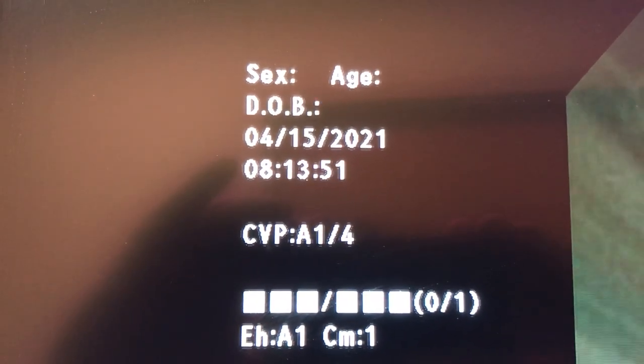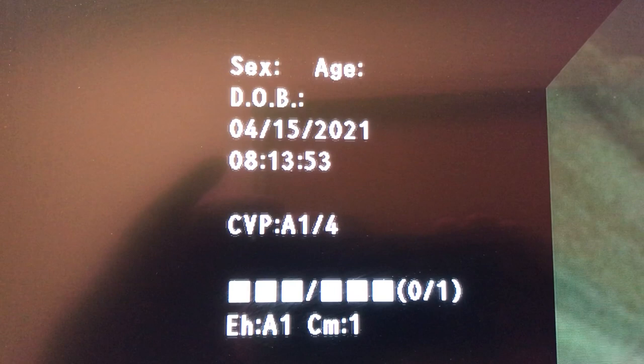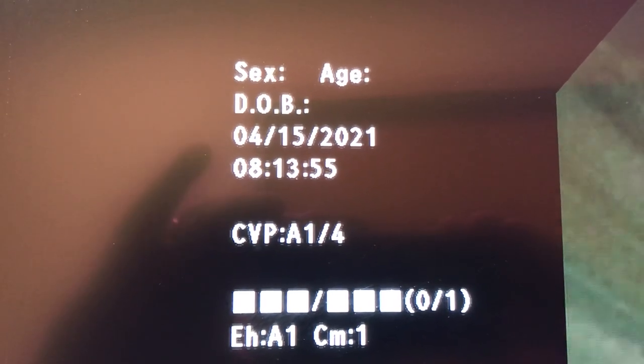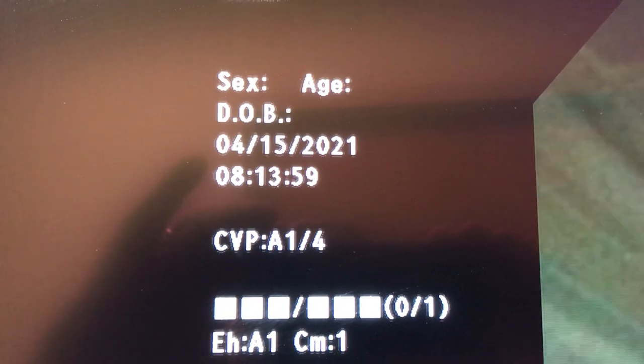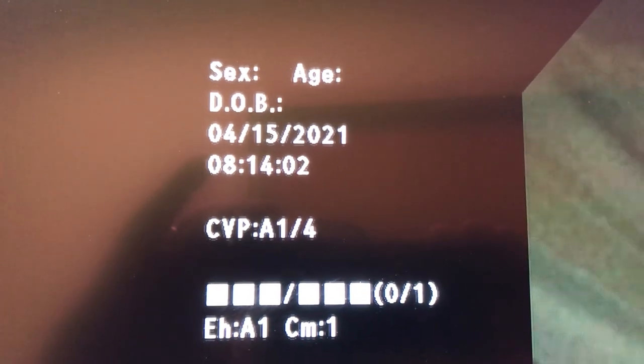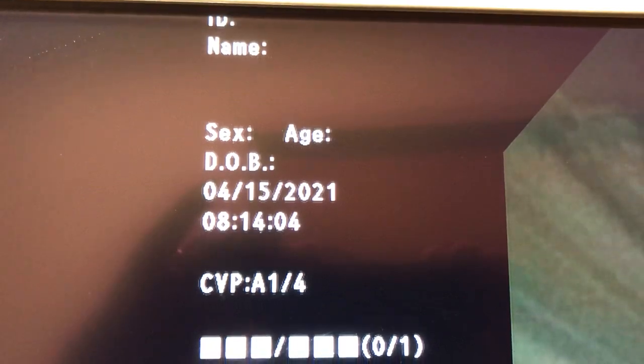This is just a short video to go over how to print pictures on the Olympus Bronchoscope. On the screen you'll want to see CVP A1-4. That lets you know that the printer is in communication with the scope and you're able to print pictures. You'll put your patient information above here.